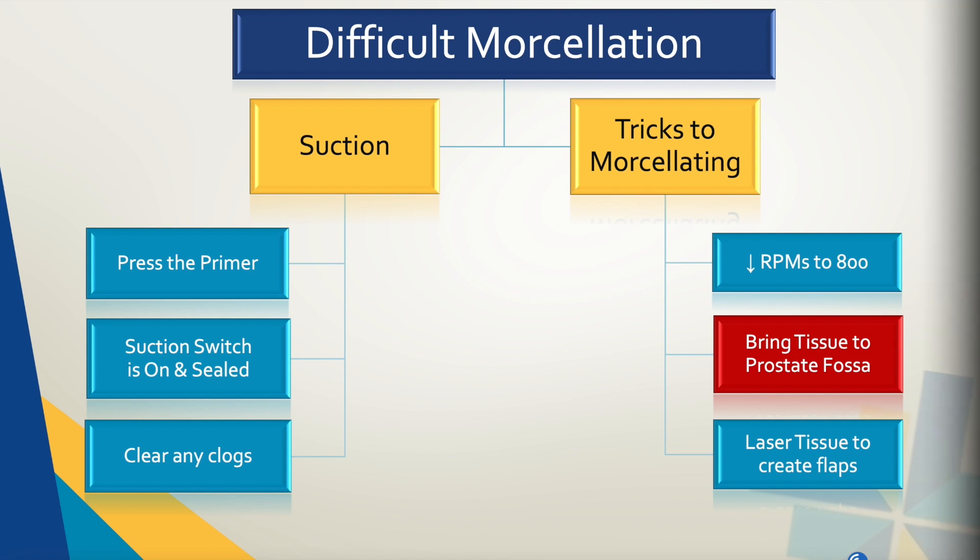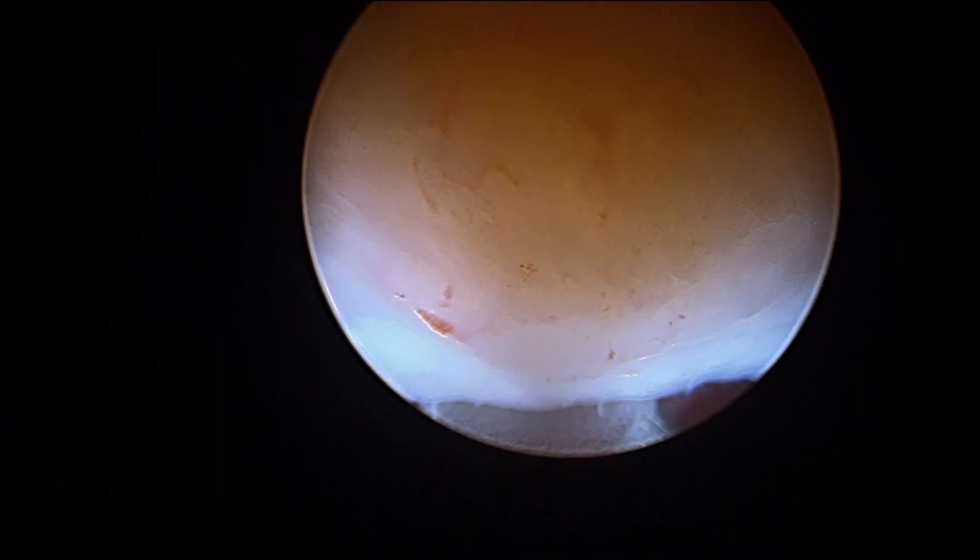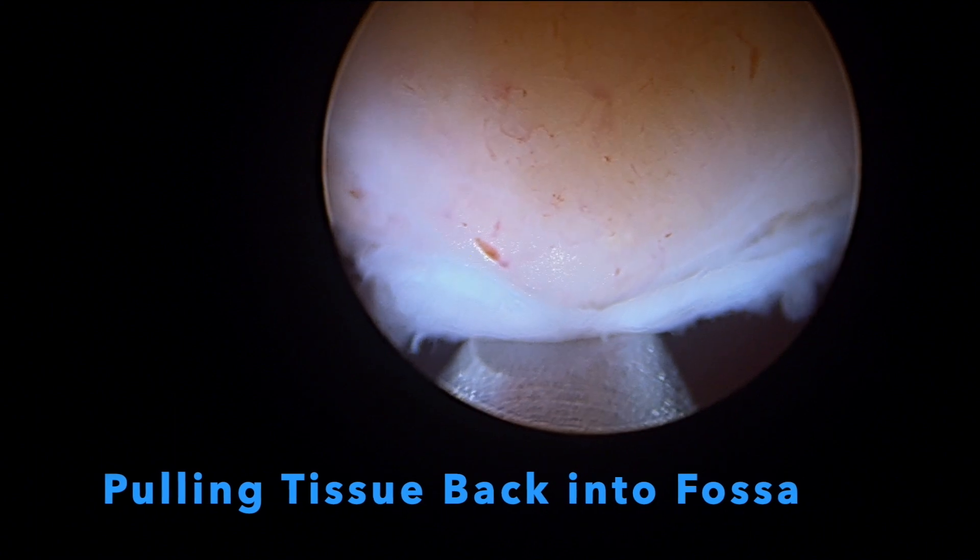Another trick you can try when the prostate fragment is smaller in size is to bring the tissue back into the prostatic fossa with suction. This can help stabilize the tissue on top of the blade and prevent disengagement.